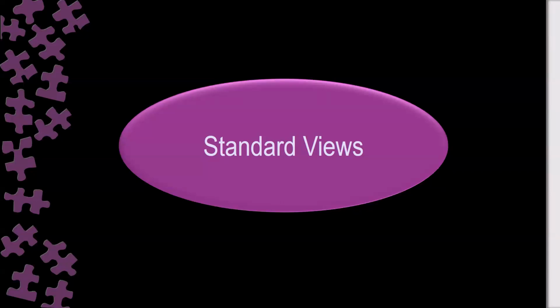Okay, so standard views done. We said any view other than the CC or mediolateral oblique view will be an additional or supplementary view. Can you give me examples of this? Sumaya, do you remember any of the additional views?